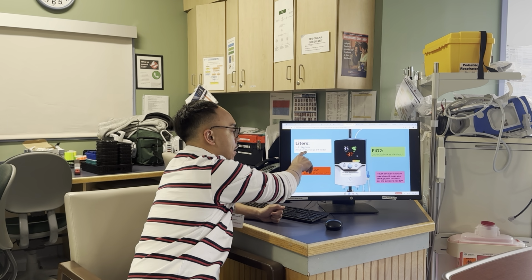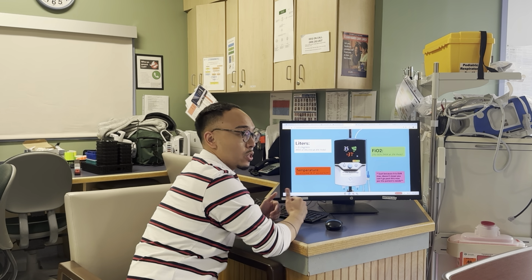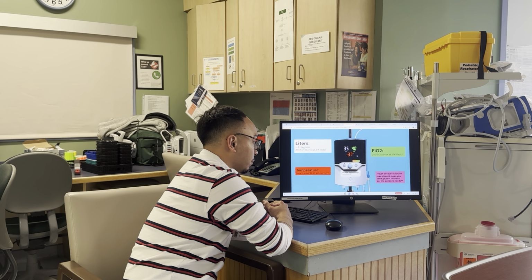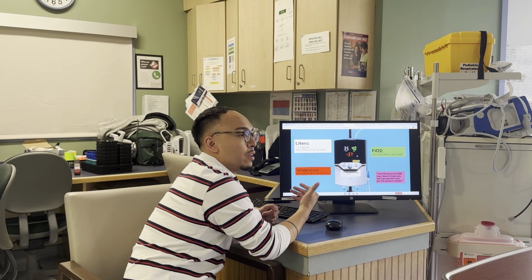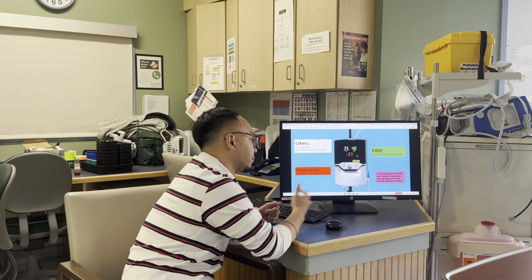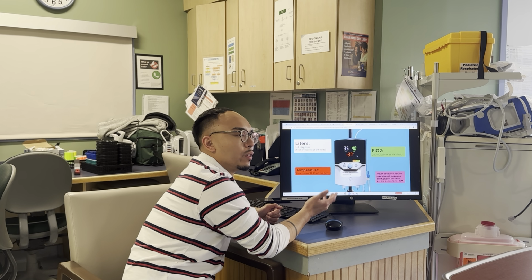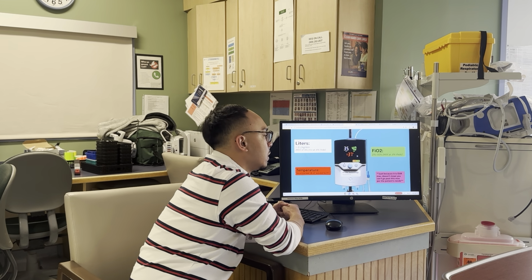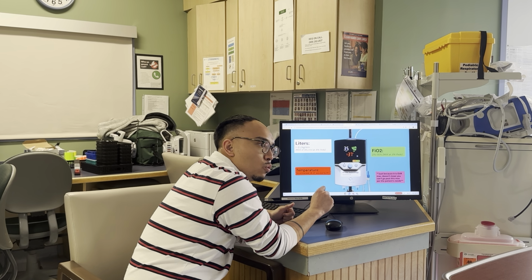And then at math also, you have to be considered at this max of 40 liters per minute here at JFK. Okay. All right, so even if, let's say a kid is 25 kilos, multiplied by 2, you get 50, that means they can't be here. But a 20 kilo multiplied by 2, you get the 40, that's the max at which we can host that kid.